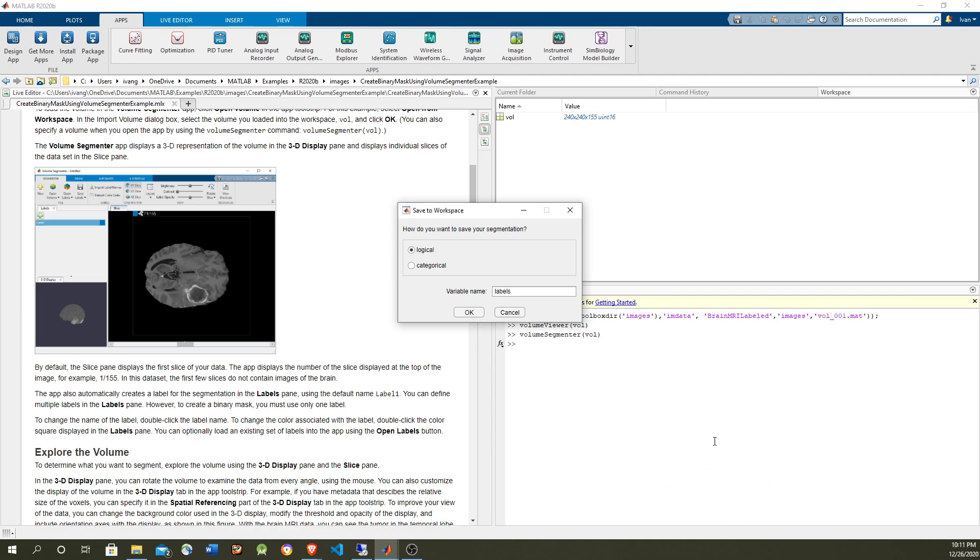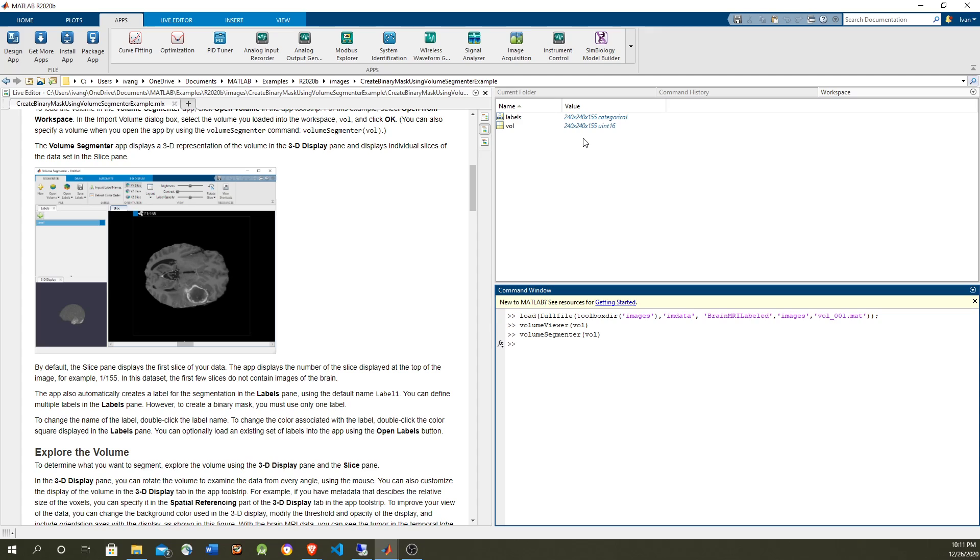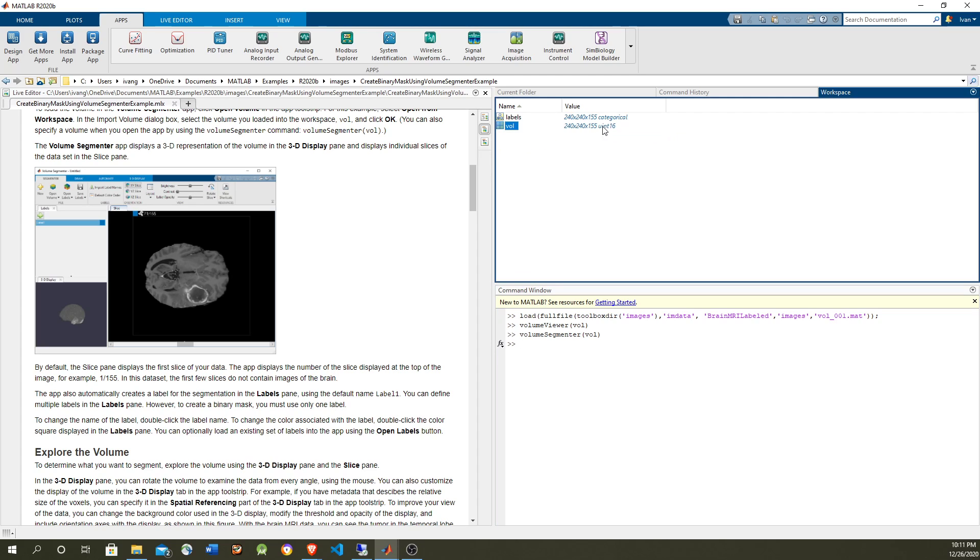We have to select if we want the value of the label to be logical, which would be a 0 or 1 Boolean, or categorical. Categorical feels better for what we're going to do now, so we're just that. You can see that both the labels and the volumes are of the same size. The difference is the base type, which this is for the color, the volume has unsigned 16, and categorical which is 0 or 1.